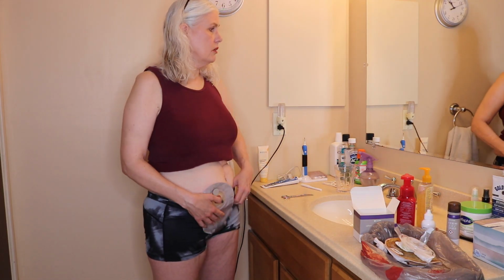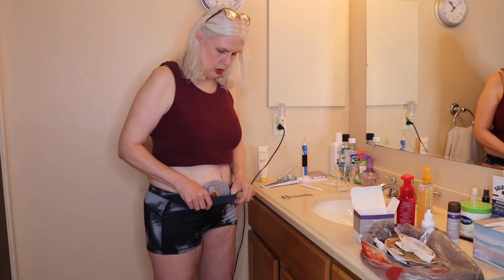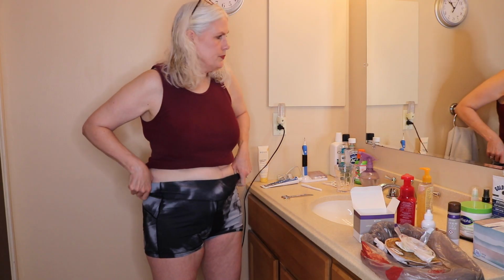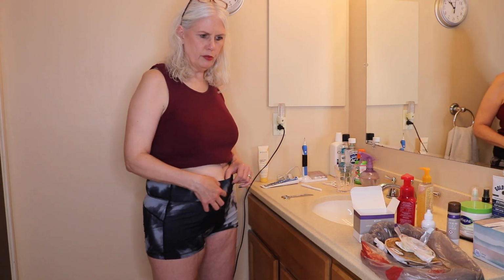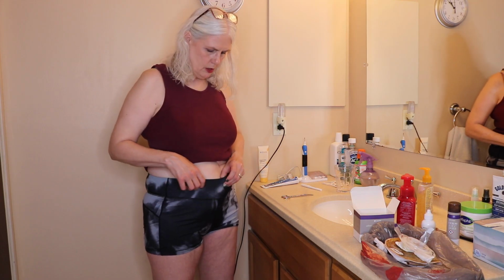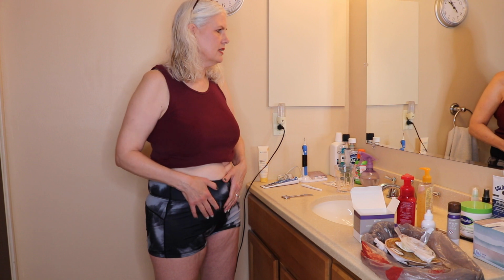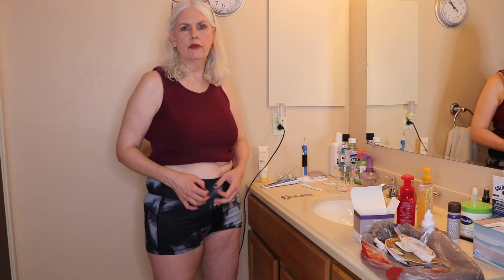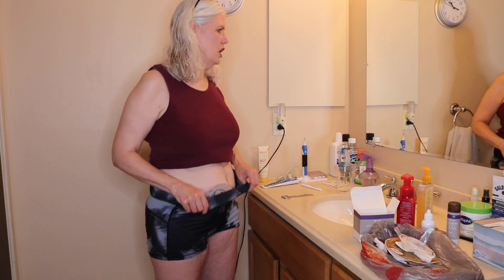That's it. Now again, you can obviously tuck it if you want. With this one, if you wanted to use a stoma dome, you can put the stickers on there and put the stoma dome on. Otherwise, for me, when there's shorts and stuff like this, it's just tight and there's not enough room for the output to go down. So again, having the stoma dome would be helpful.